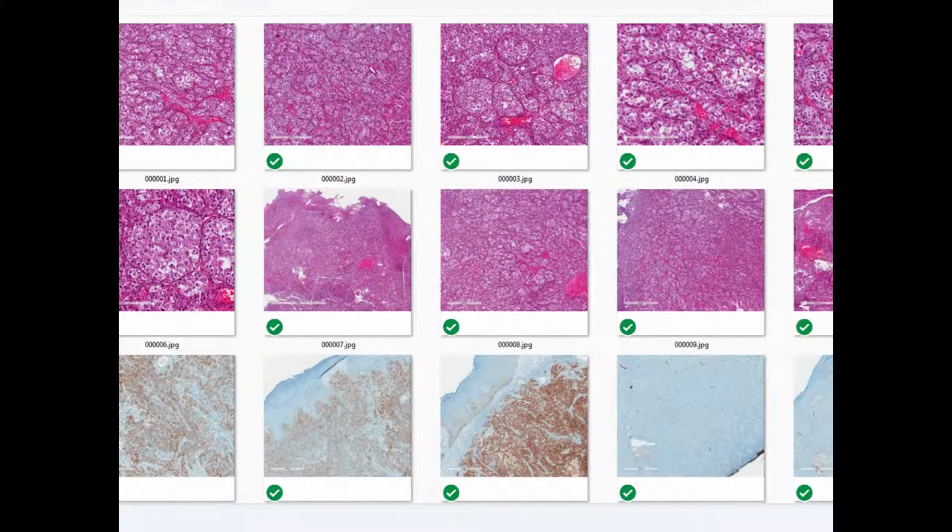How many of you have a collection of photomicrographs on your computer, taken from things like tumor board, that you wish you could share with your colleagues or residents more effectively? I'm talking about photomicrographs, not whole slide images. You know, the photos that only take a couple of minutes to snap while you're working. The goal of our project was to develop an easy way to take these still images and get them out there in an easily accessible way.